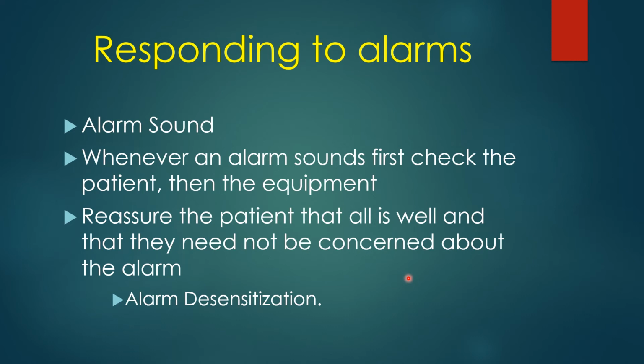Now, if you're working in a neonatal nursery, you need to be aware that these loud alarms are not good for babies. These babies need a lot of sleep, and if their sleep is disturbed frequently by loud ventilator alarms, they don't thrive. They don't gain weight. They don't do well. So that's another situation where you have to be very aware of the alarms and the alarm volume and the sounds of the alarms.